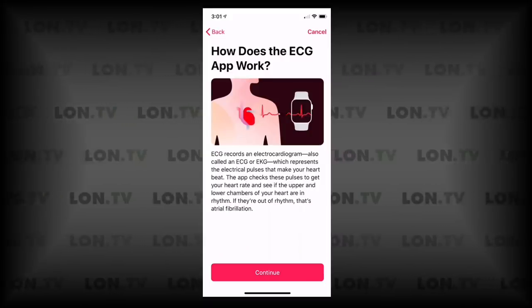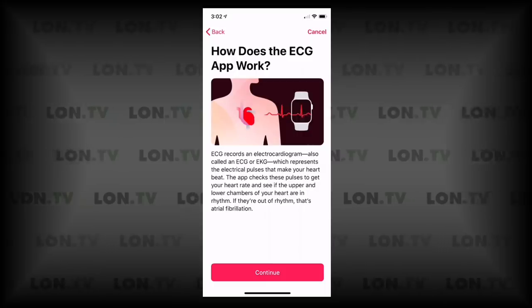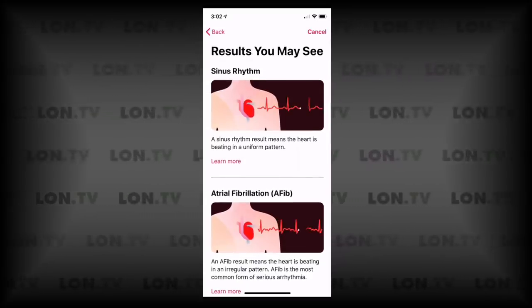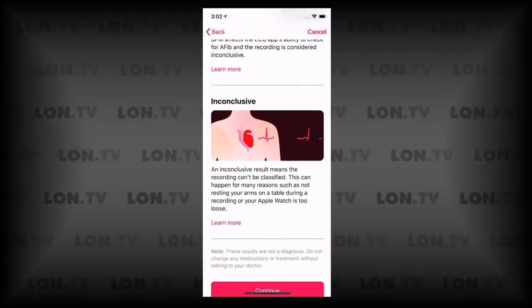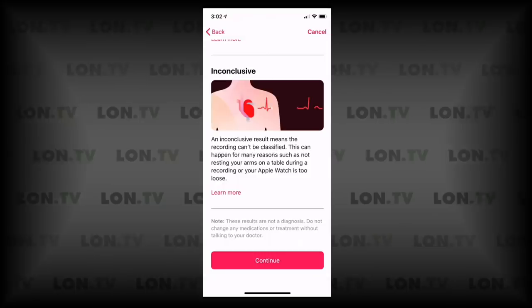The next step is to get some information about what it does. It's telling you exactly what it's looking for — whether or not it's going to detect atrial fibrillation, also known as AFib. A sinus rhythm result means the heart is beating in a uniform pattern. An AFib result means it's not beating in a regular pattern and you should get looked at. It may also come back as low or high heart rate, or inconclusive. Now this does have regulatory approval in the U.S., but it's a different type than a certified medical device, so if you're not feeling well, don't rely on the app — go to the doctor for a more conclusive decision.